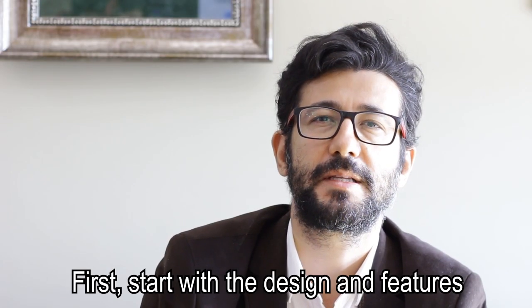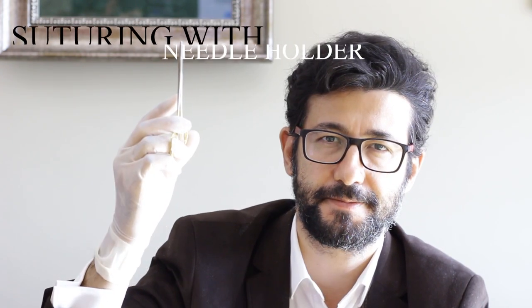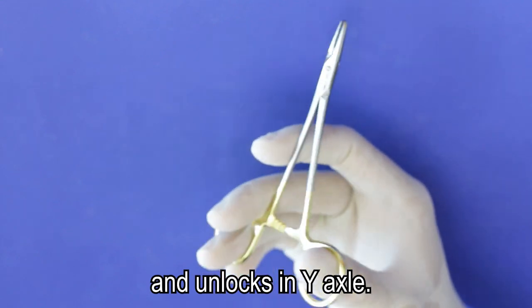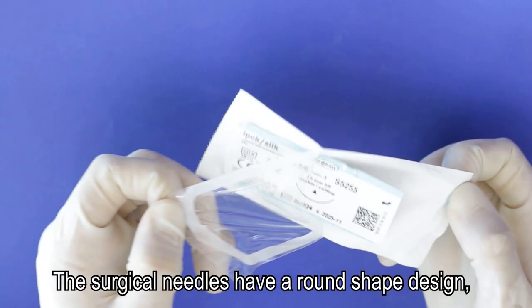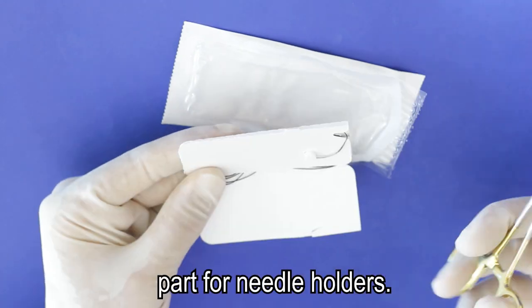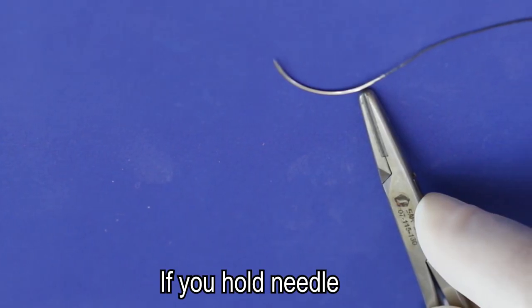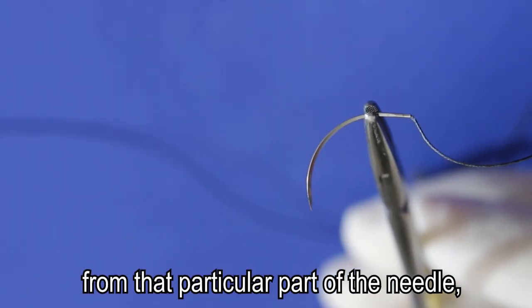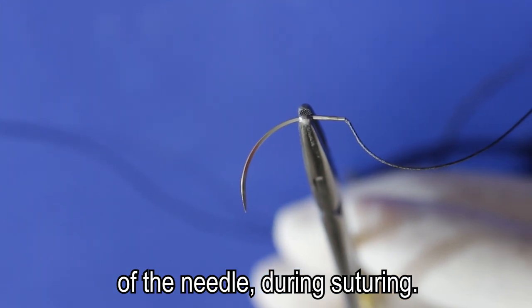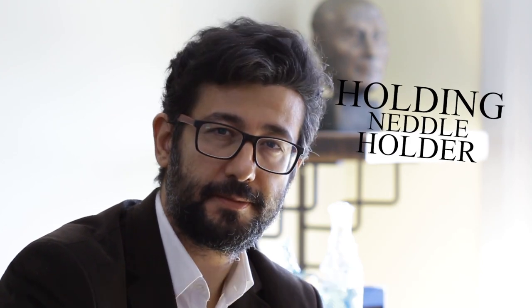First, start with the design and features of a needle holder. It locks itself in the X axis and unlocks in the Y axis. The surgical needles have a round shape design. They have a straighter part for needle holders. If you hold the needle from that particular part, you eliminate the dislocation risk of the needle during suturing. Now, see how we hold the needle holder.